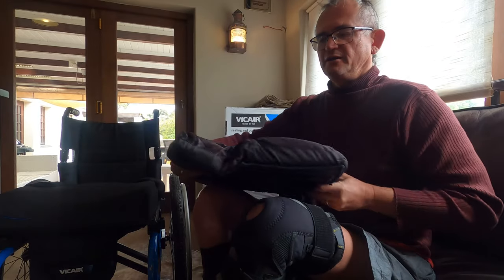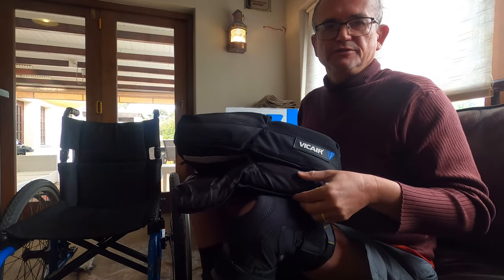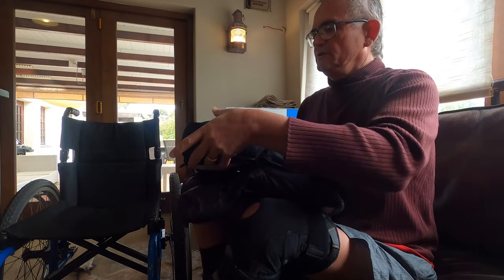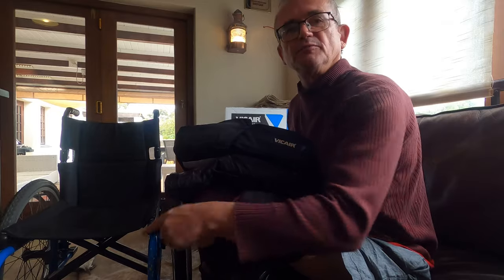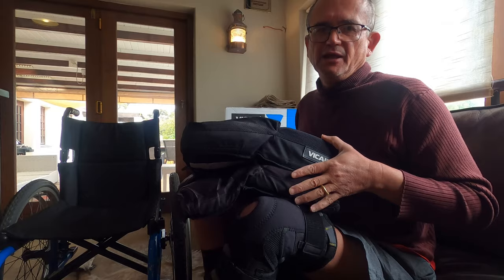I'm two weeks into using my new Vicair O2 Active 9 cushion and so far I'm quite impressed. There are quite a few things I need to adapt to — we are all individuals and we have different needs. This is my old Vicair cushion and this is the new one. As you can see the front is considerably higher, as well as the back. I use my legs a little bit so I don't have foot plates on my chair, so this height was quite an adaption for me and I had to make some changes.